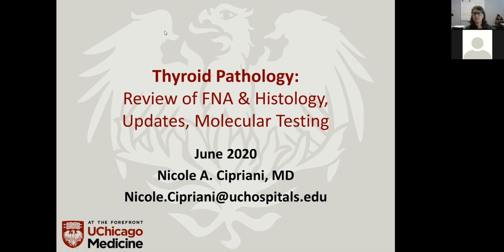So based on some requests, what I think we'll talk about today is going to be a review of some basic thyroid pathology, including FNA as well as histology.